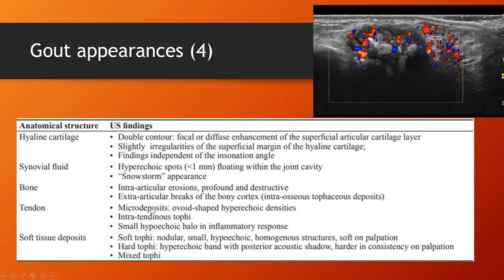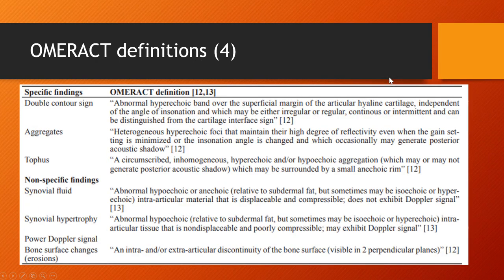We may see tiny little flecks within tendons. Tophaceous gout can sometimes give you great big echogenic nodules that may or may not have a shadow. So there's 2 forms of tophi, soft and hard. So over here we can see a form of tophaceous gout that has affected the MTP, and it's a common cause for pain in the MTP, particularly of the hallux.